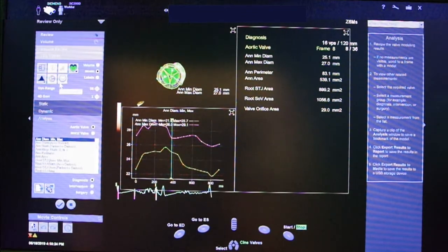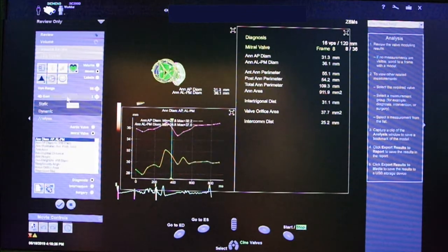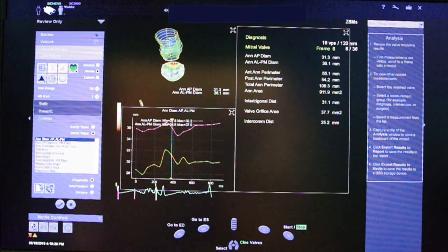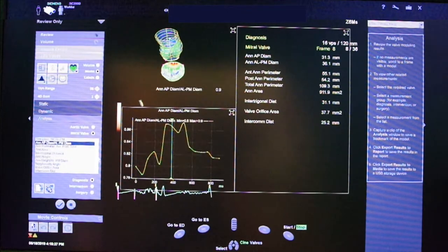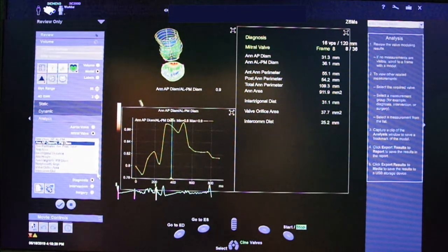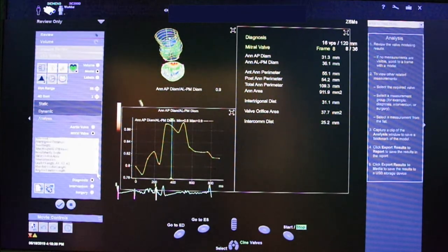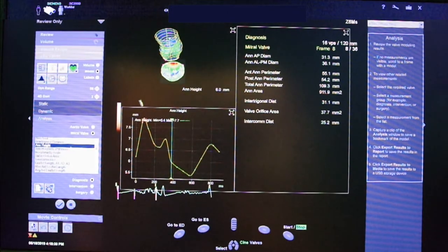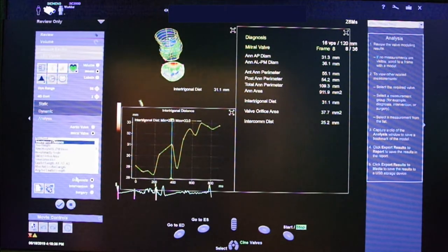The variables for both the aortic and the mitral valve are displayed in the chart, while the graph shows the modification of the variables along the cardiac cycle.